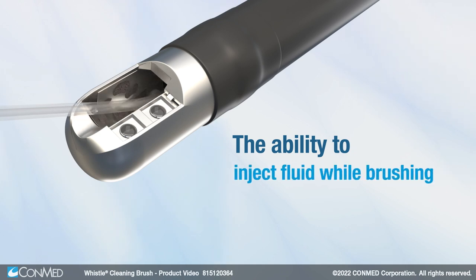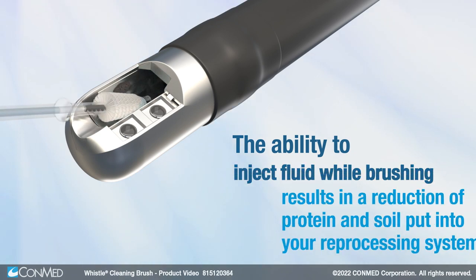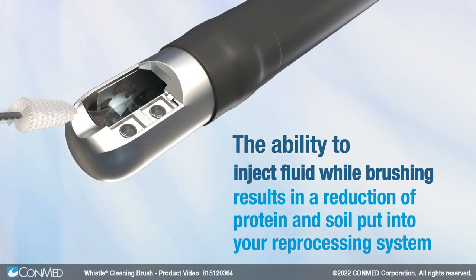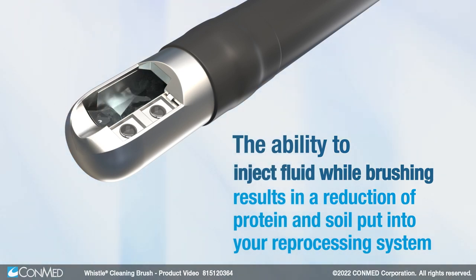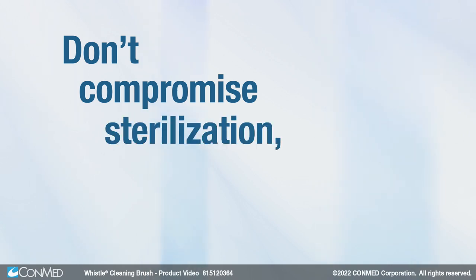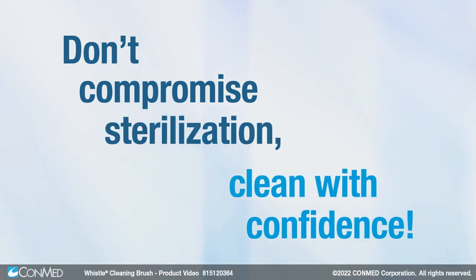The ability to inject fluid while brushing results in a reduction of protein and soil put into your reprocessing system when sterilizing the scope. Don't compromise sterilization — clean with confidence.